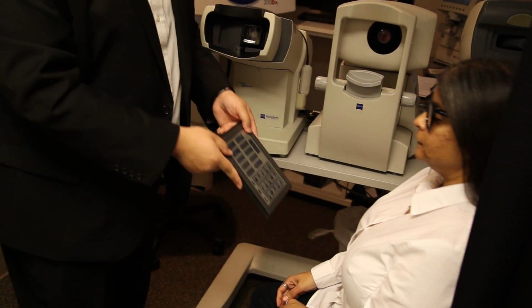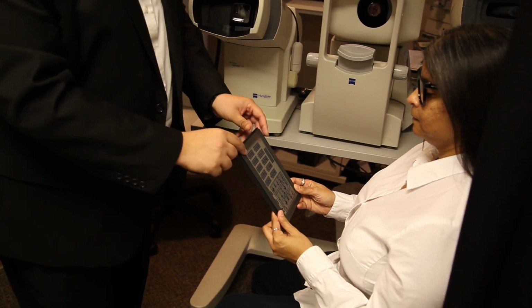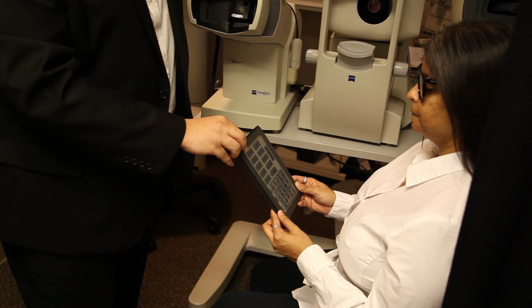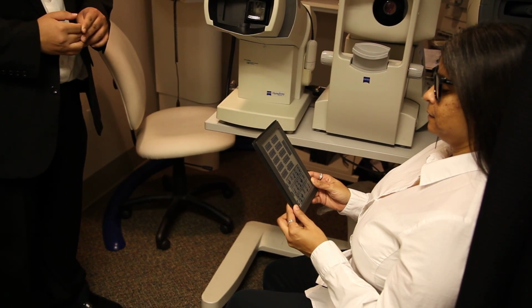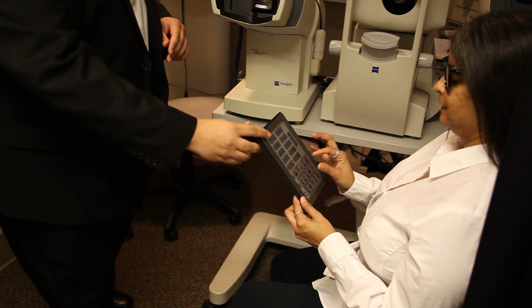Alright, so Mrs. Test, if you'll hold this right about here, take a look at pictures 1 through 5. In each one of the pictures, one of the circles may appear to you as if it's popping out in 3D. If it does, I want you to tell me which one it is by indicating either left, middle, or right, starting with number 1. Left, right, left, middle, right. Okay, great.